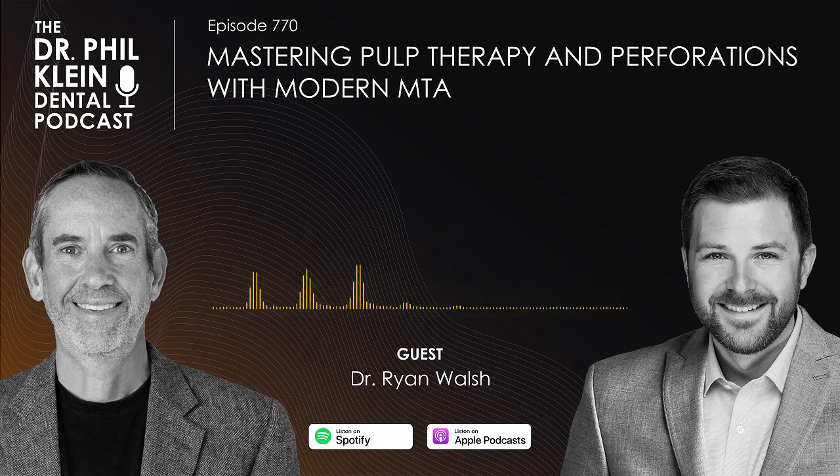So when you place MTA, it reacts with moisture and releases calcium ions, which helps stimulate the formation of reparative dentin. And at the same time, it creates a high pH environment that's naturally antibacterial. And that's important because it not only physically protects the pulp, but as I mentioned, it's antimicrobial and it supports healing.